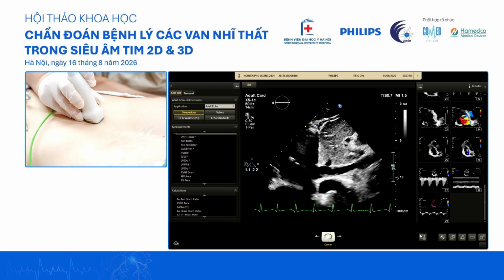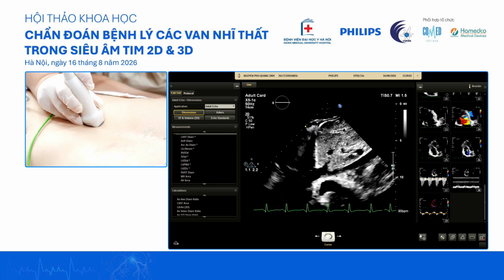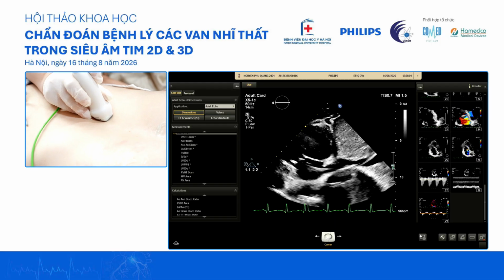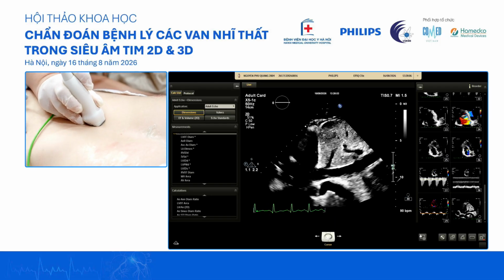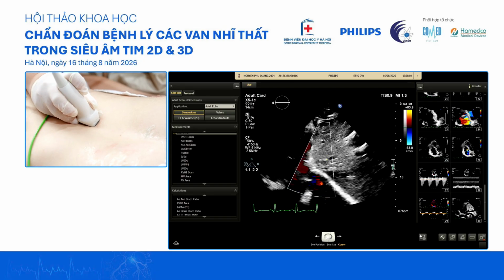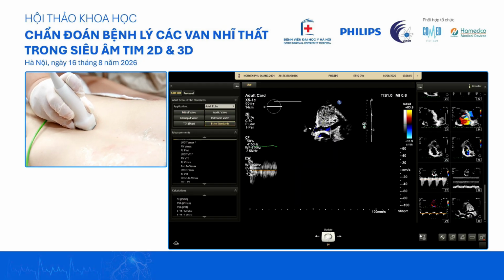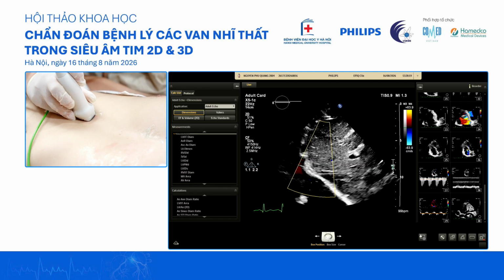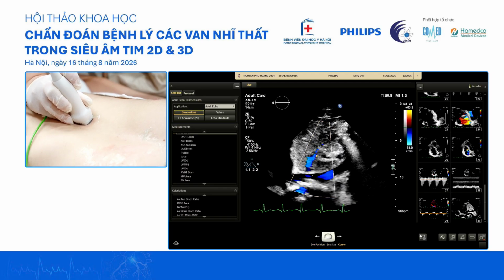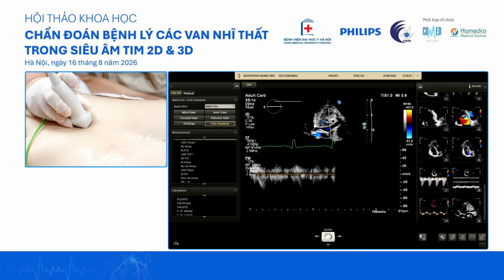RV volume? We'll also take the hepatic vein. Đánh giá phổ Doppler và tĩnh mạch gan. So in the hepatic vein, we'll also see if there's any reversal as an indication of the severity of the tricuspid regurgitation.